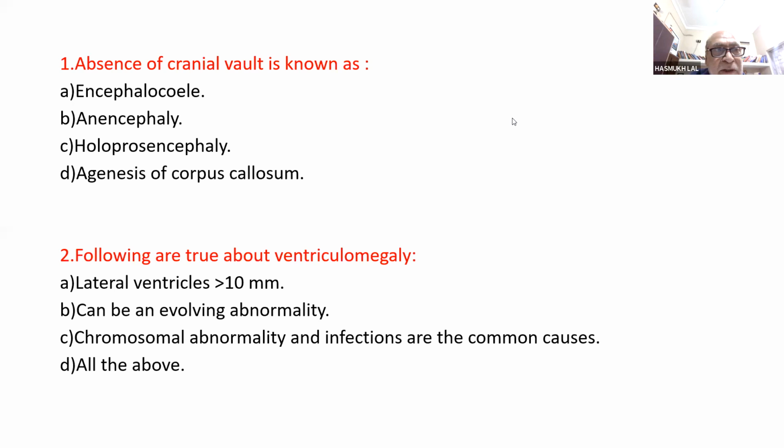We can't measure BPD in these fetuses, and the entire brain is almost missing because the amniotic fluid has eroded it. So it is called acrania anencephaly sequence.